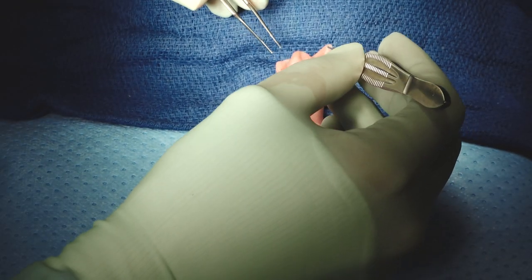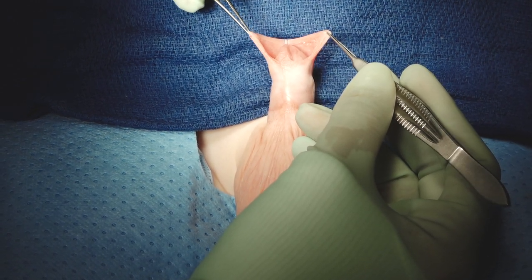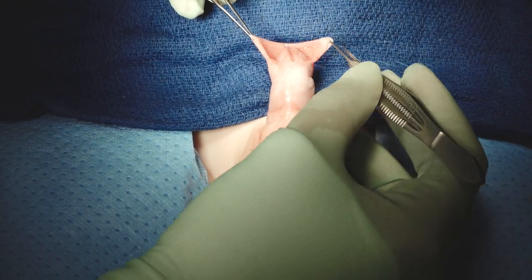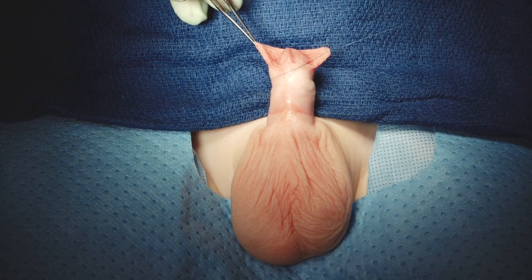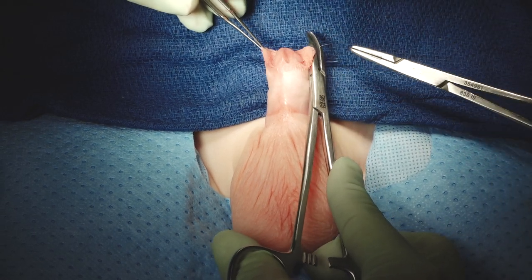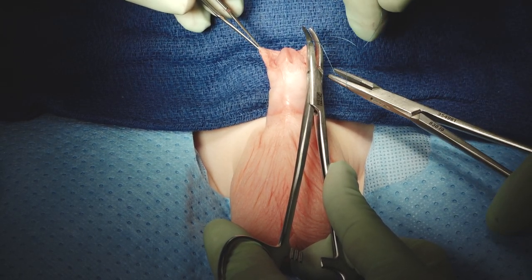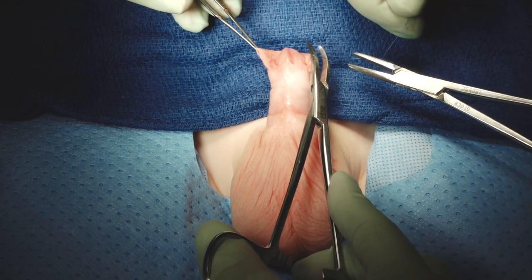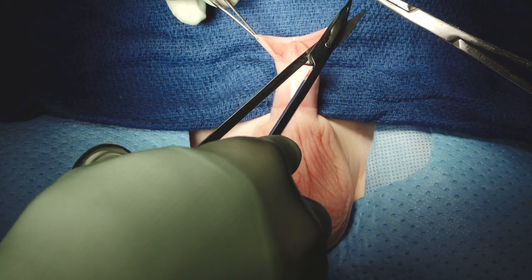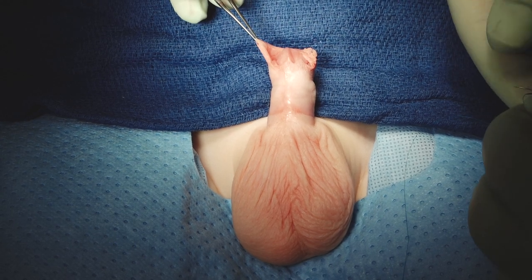We start our skin incision a little differently now because we see so much curvature. We don't suspect this patient has curvature based on our pre-op exam, but we thought it's a really good idea to get into the habit of degloving ventrally. This is important for those of you in countries where foreskin reconstruction should be the norm, and also because up to about a third of patients with distal hypospadias can have significant curvature — this is a good way to start your incision so you don't make a wrong decision.